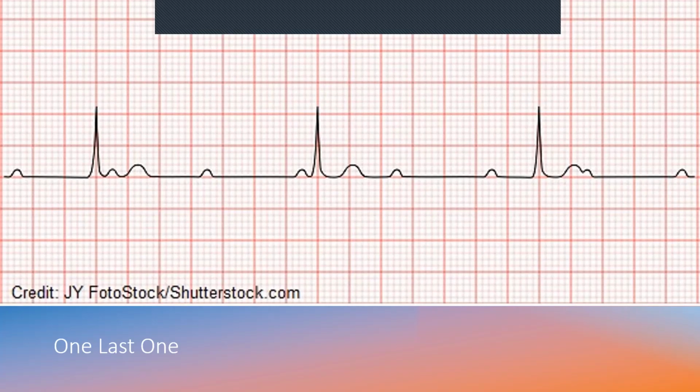So you have an ectopic pacemaker cell. So this particular patient has an ectopic pacemaker that's going at a slower rate. So technically the AV node is getting instructions from above. It's just the wrong instructions. It's kind of like you ask Dr. Somo about a pulmonary embolus. She's giving you the answer, but it's not the right answer. Nothing against Dr. Somo, but she doesn't deal with pulmonary embolus in the emergency department. You get what I mean, all right?